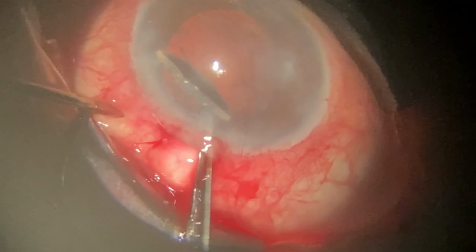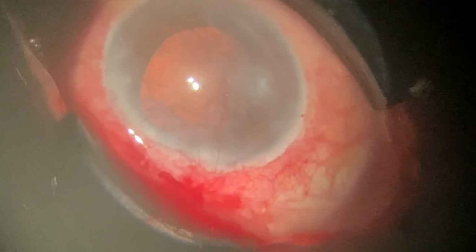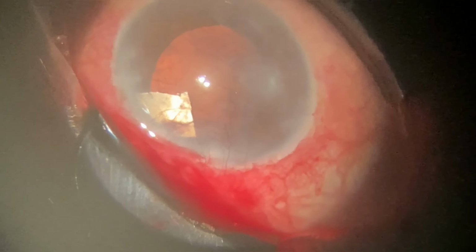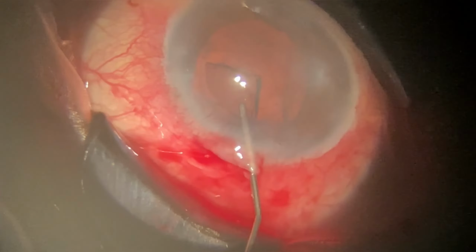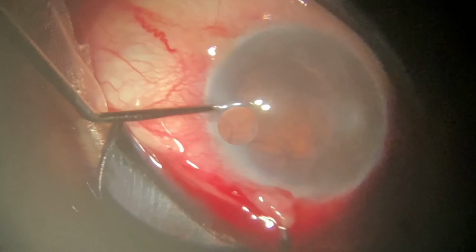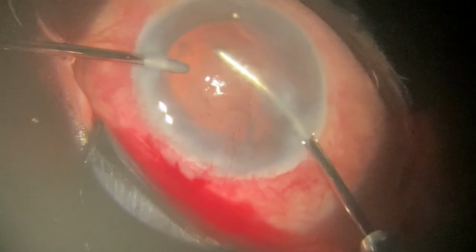While taking it out, we should keep in mind that the round edge should be used as the fulcrum rather than the ragged edge. The second part is also removed, and then this one is the third part of the intraocular lens. I am taking it to the center so that it can be easily held and taken out. This is the final part, again taken out by using the round edge as a fulcrum.